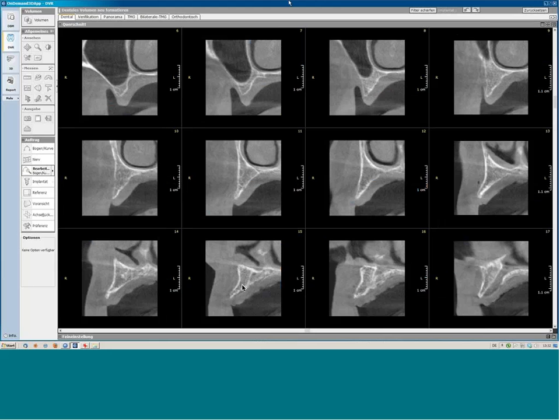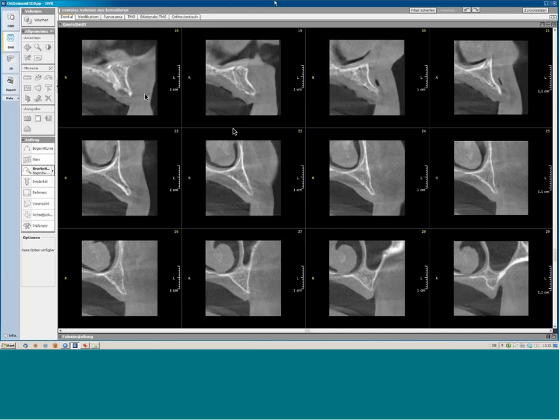also is propagated here to the incisor region, and here we are on the other side, on the left-hand side of the upper jaw, and once again, very thin alveolar process in the canine region, and finally, again, this typical atrophy in the side area.